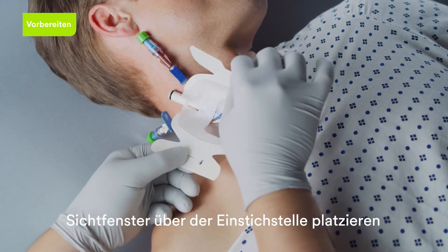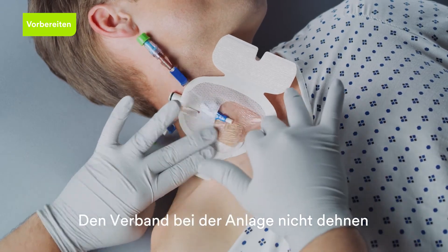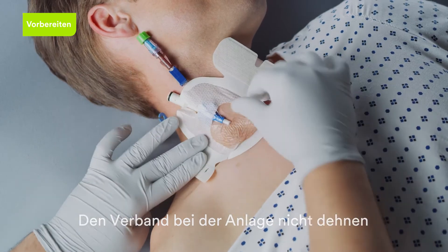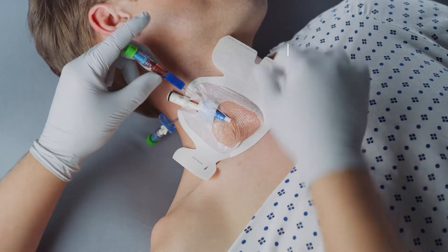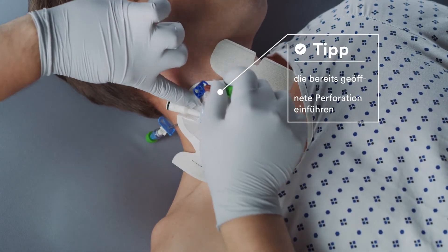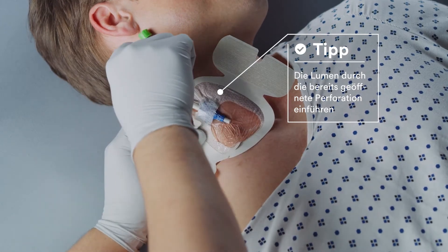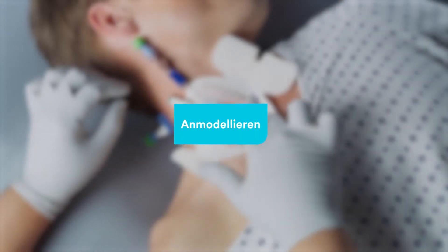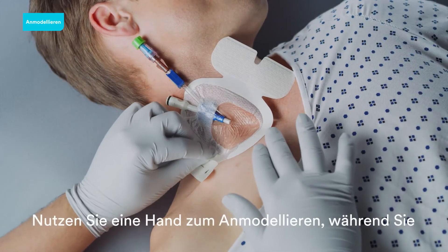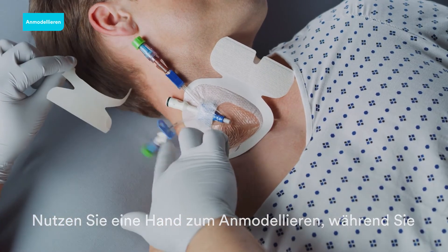Place the dressing window over the insertion site. Be sure not to stretch the dressing during application. Apply firm pressure to the securement border with one hand while removing the border frame with the opposite hand.